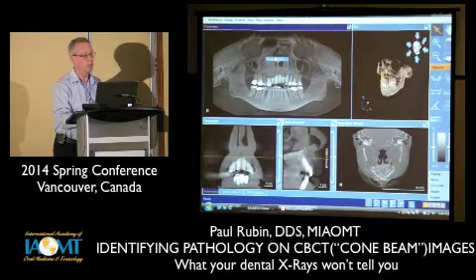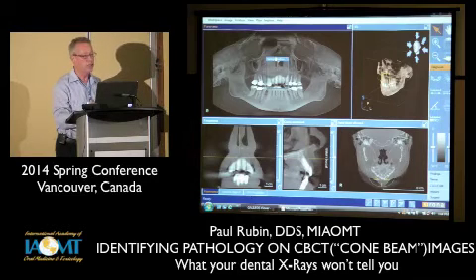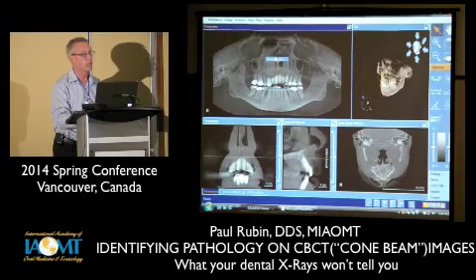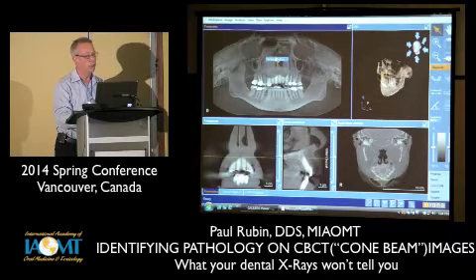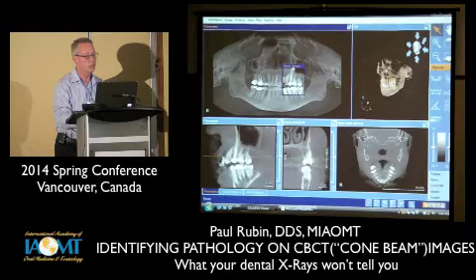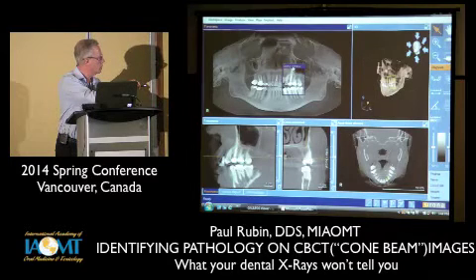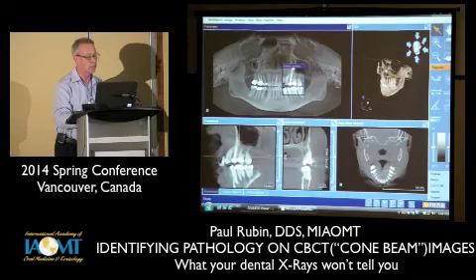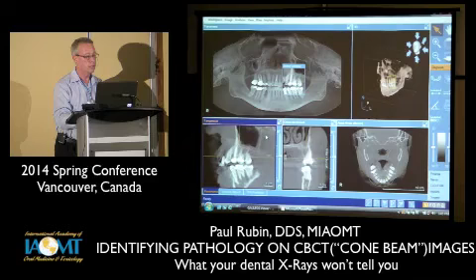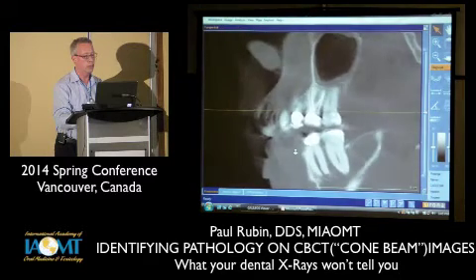For example, on this patient, there was a question of this upper left molar, number 14, is there a problem with this root canal? A periapical view didn't really show that well. If we slide this slicing window over this tooth, now we can look down on this view and look at slices in and out and get a little better sense of what's going on here. So I'm going to enlarge this window. And as we go in and out, we can start seeing different things.